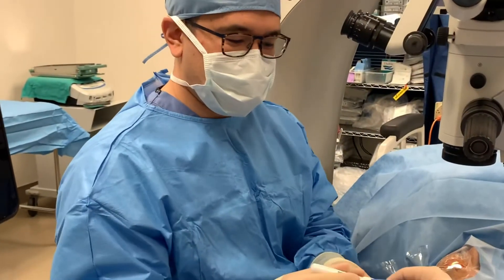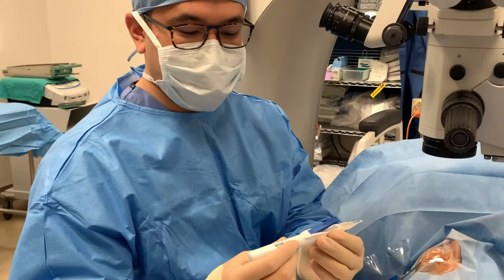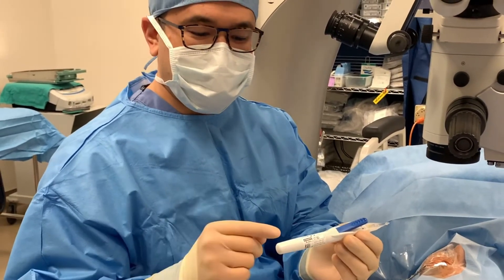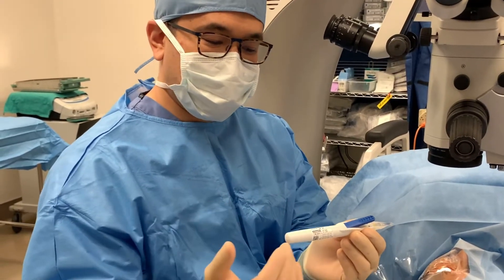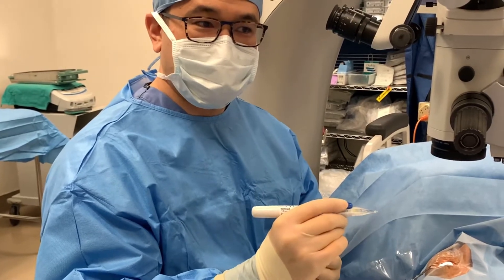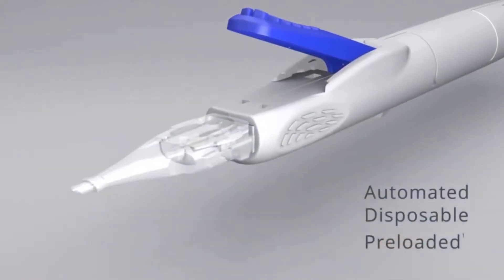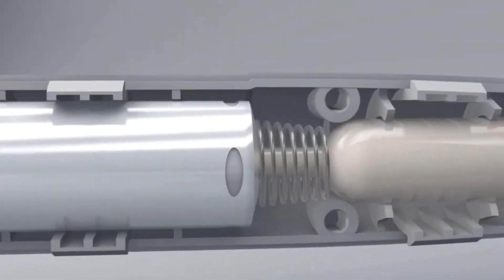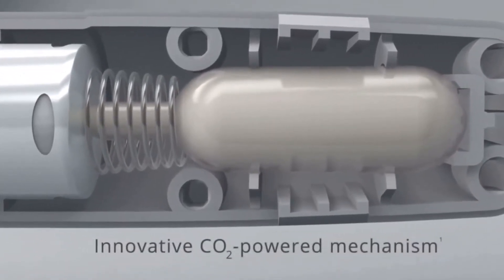This is the new lens, the Clarion, and it has a new delivery system. What's nice about it is that there is a pressurized CO2 cartridge inside it that allows us to deliver the lens single-handedly. All we need to do is press the button here, which breaks the seal, and now we're ready to start. It comes in a preloaded cartridge with compressed CO2 gas so that there's easy one-handed control and delivery of the lens into the eye.